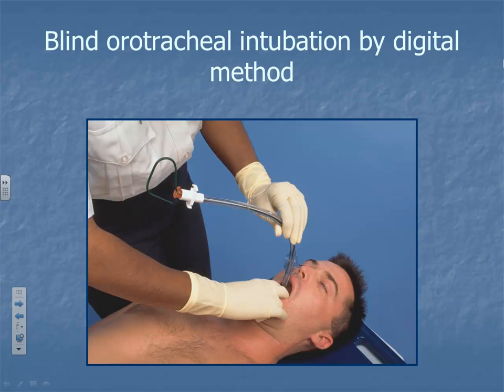Any patient that you're going to digitally intubate, what must be their mental status? They must be profoundly unconscious. Like this guy, I mean, he was so unconscious, we kicked him several times by accident. And just trying to get to him. But he was profoundly unconscious, so we were able to do this. Because if they're not completely unconscious, is there a danger with putting your hands in patient mouth?